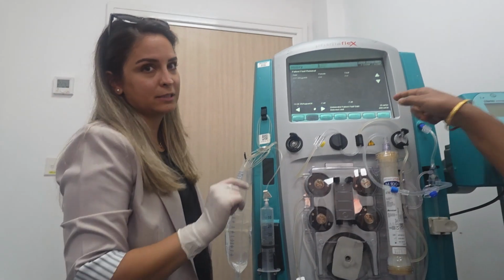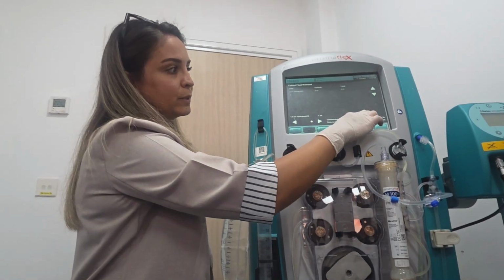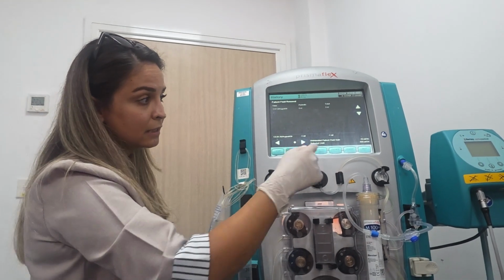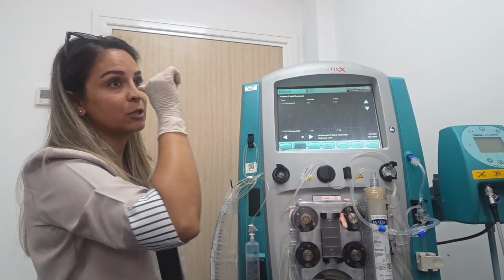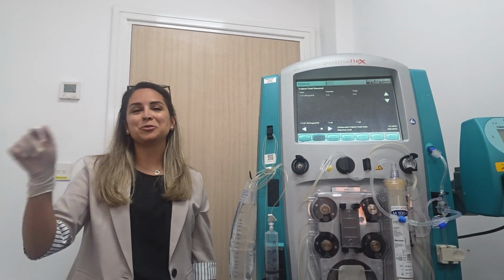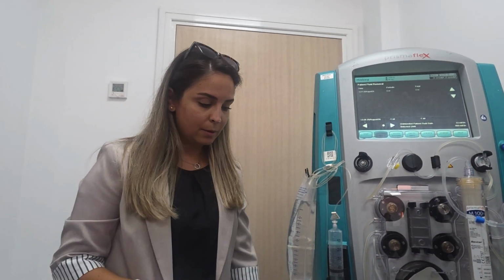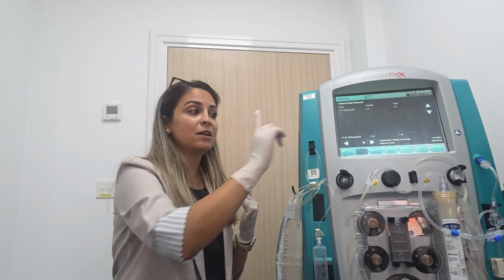Fluid gain: the unintended patient fluid gain or loss. See now it's 25. If it keeps increasing, once it reaches 400, the machine will stop. There is a warning to stop the session. So please be careful. Be careful that none of the lines are touching the bags, not even the warmer, not even the bed.